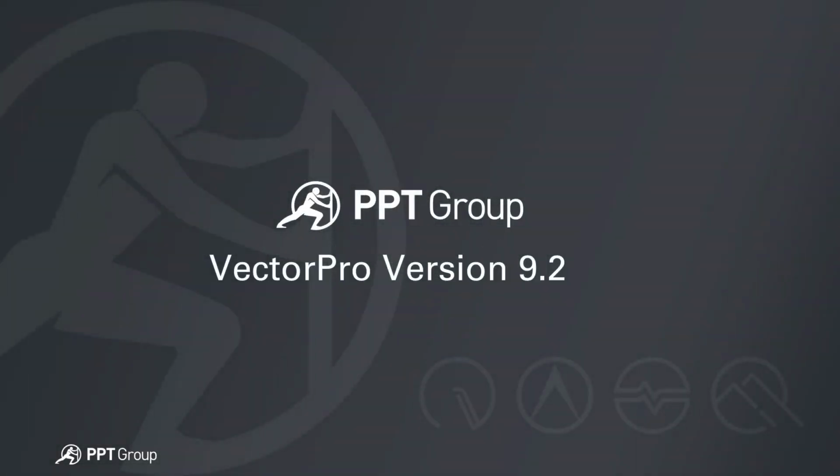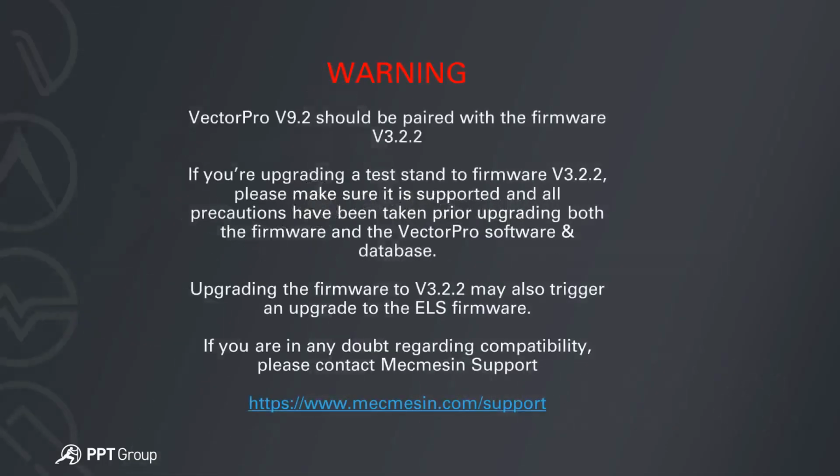If you're upgrading to 9.2, you should really pair it with firmware version 3.2.2. When you're upgrading the firmware and the software, please take all precautions. Upgrading firmware may also trigger an ELS firmware upgrade, but if you're in any doubts, please contact technical support who will be able to assist you.